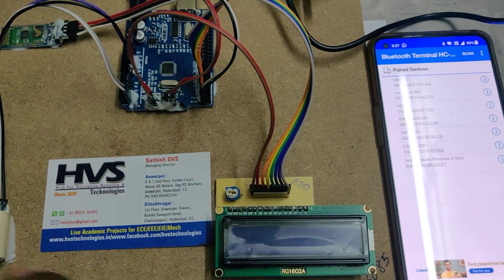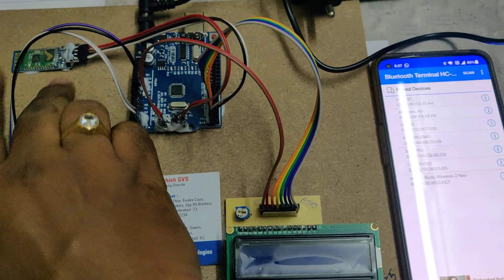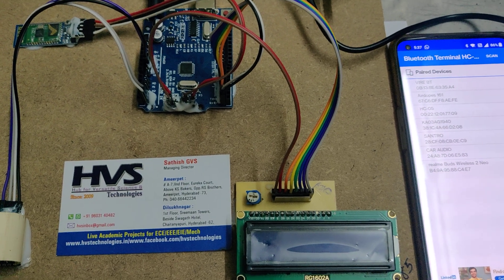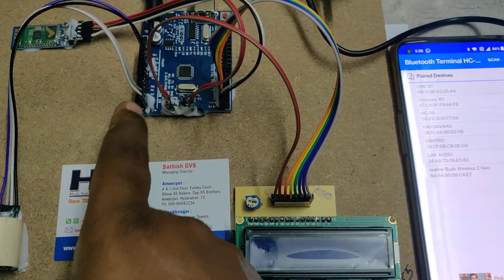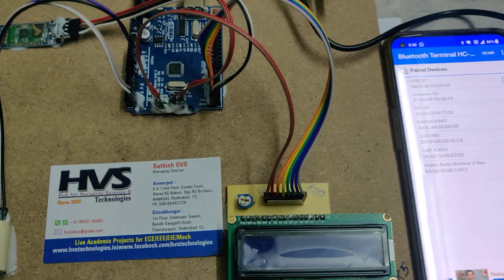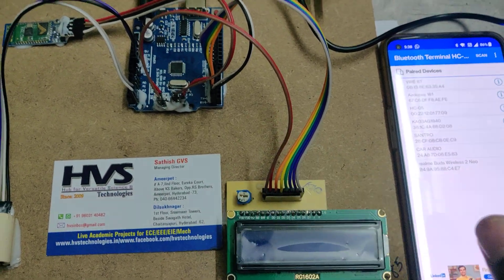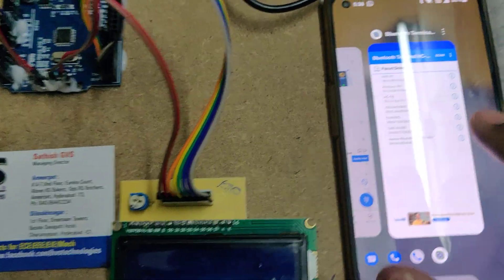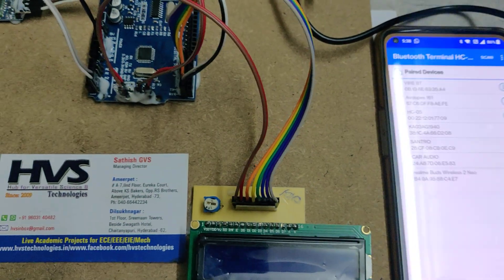The glucose data is also sent continuously to the mobile phone through the HC-05 Bluetooth module. The customized sensor is interfaced at pins A4 and A5, the Bluetooth module at pins 0 and 1, and the LCD is interfaced from pin 2 to pin 7 of the Arduino board. Before the demonstration, install the Blue Terminal application from the Play Store.